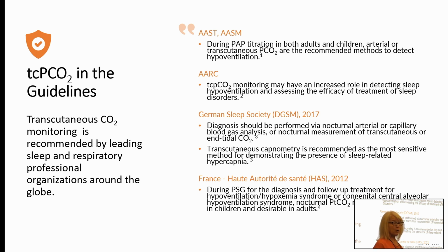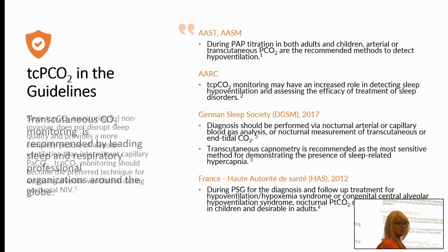The French Health Authority states that during PSG for the diagnosis and the follow-up treatment for hypoventilation hypoxemia syndrome or congenital central hypoventilation syndrome, nocturnal transcutaneous monitoring is necessary in children and desirable in adults.